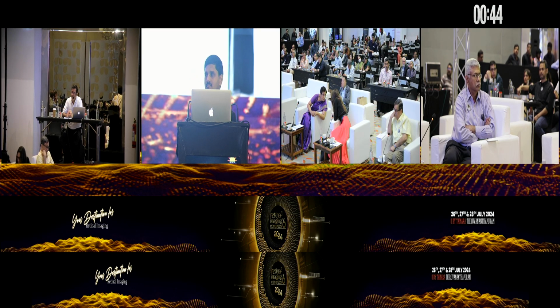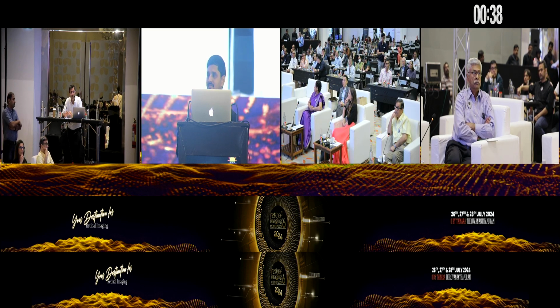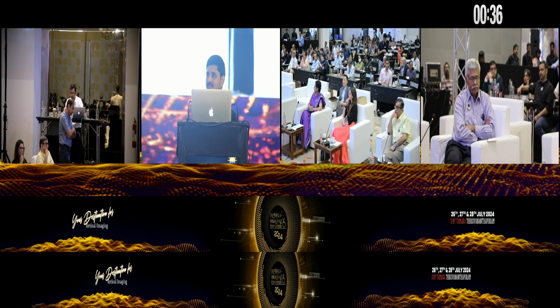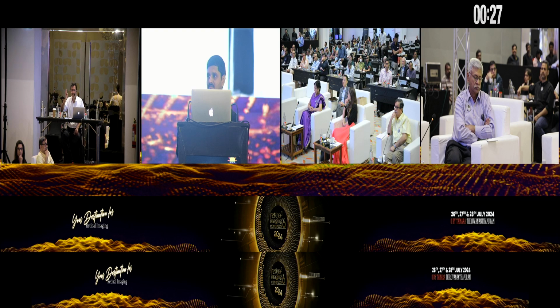Pradeep, while we have 40 seconds left, I wanted to ask you one more last question. If you are dealing with a DLS, just to summarize in one line, whether there is a DLS, a thin DLS, or a thick DLS, or subretinal fluid, or intraretinal fluid, or SHRM, which biomarker do you want everybody to worry about most?